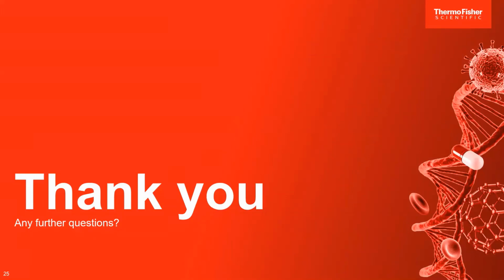Important indeed, and as the usual saying goes, garbage in. Definitely. So they say. And Kate has a follow-up question on that. Kate Slimani from the CDC Atlanta. Thank you, Kate, for joining. She said, for saliva, do you recommend neat saliva without preservatives or additives? So the kit itself is a self-contained kit, and the input is actually just neat saliva.